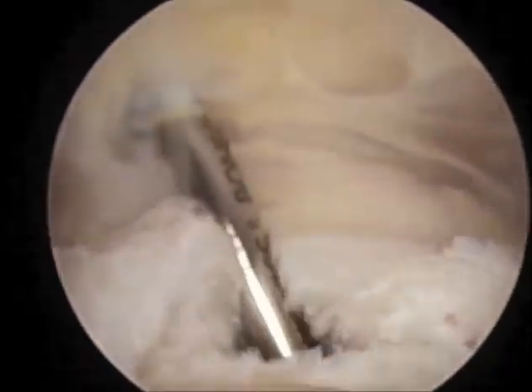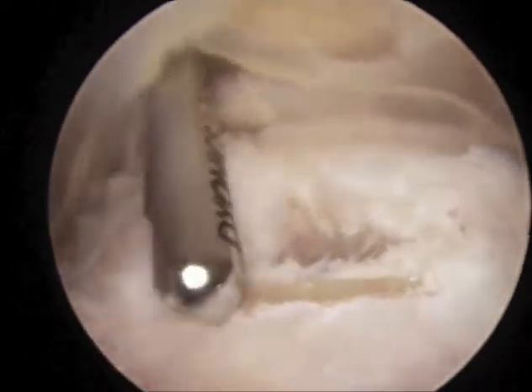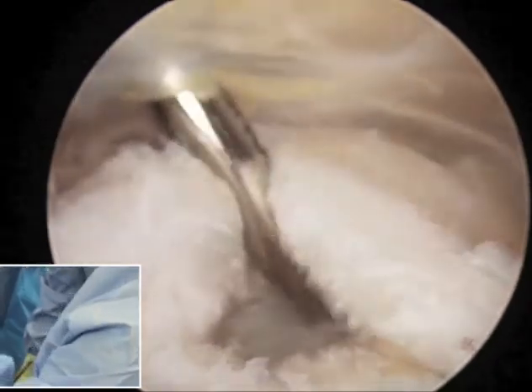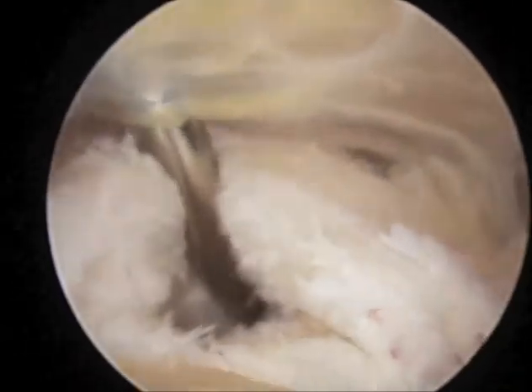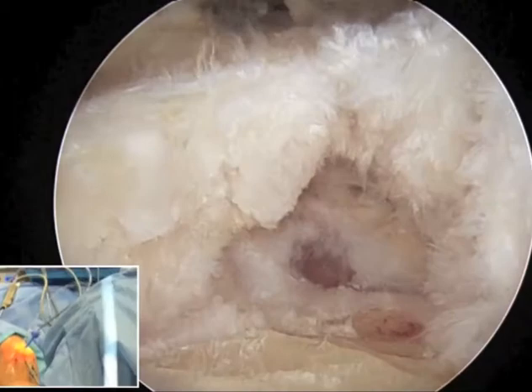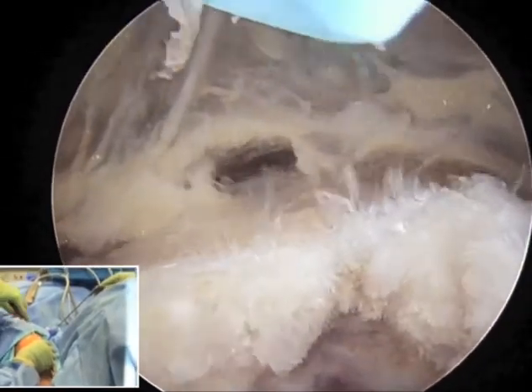Arthroscopic triceps repair in this right elbow. We are shaving through a proximal central portal. We've already debrided away the bone spur and we're left with a triceps central tendon defect as seen here. As we debride, you can see the damage to the triceps tendon and we're removing all the damaged tissue. Here you can see into the ulno-humeral joint, so at this point we need to do a repair.